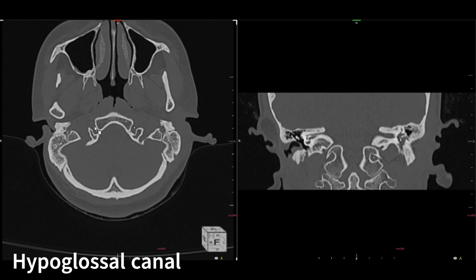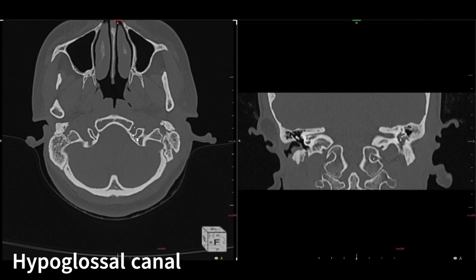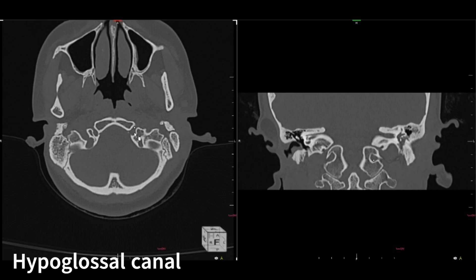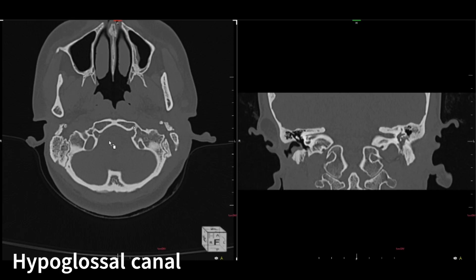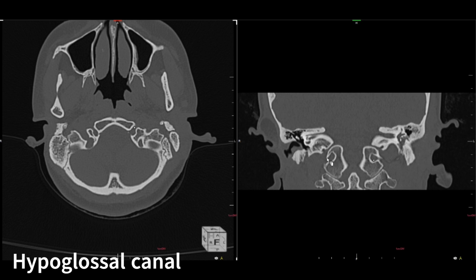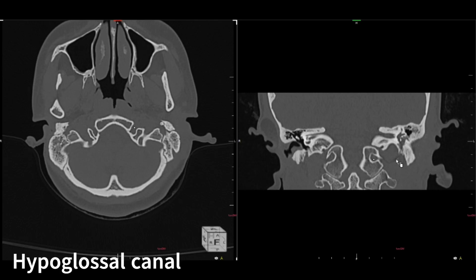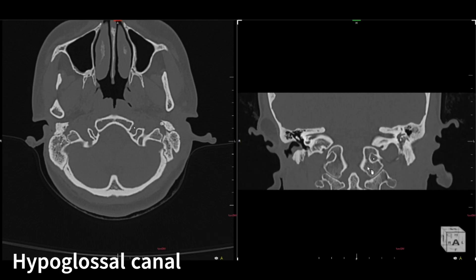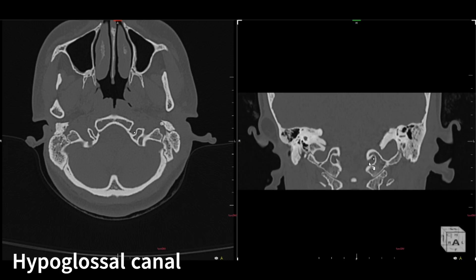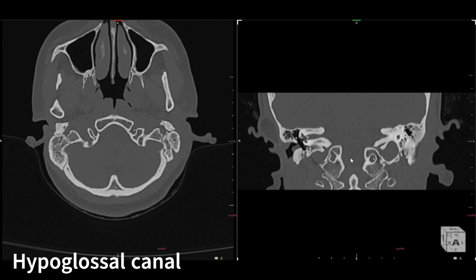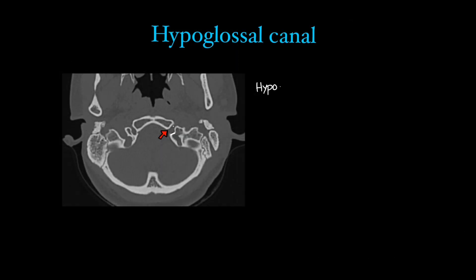Next we have the hypoglossal canal, which is on either side of the clivus and easy to identify bilaterally. On either side of the clivus you can see the hypoglossal canal within the eagle-shaped bony structures — these are the occipital condyles. Through the occipital condyles you can see the hypoglossal canal.